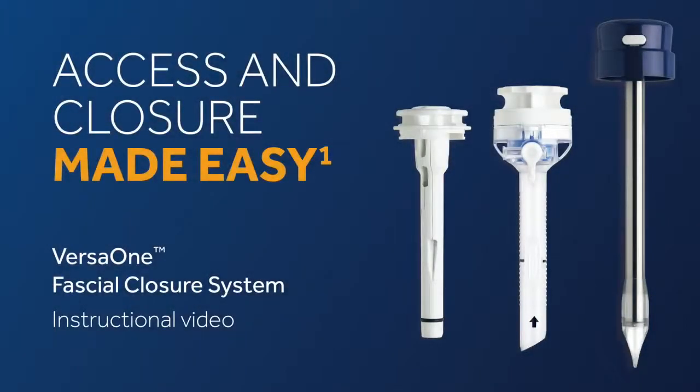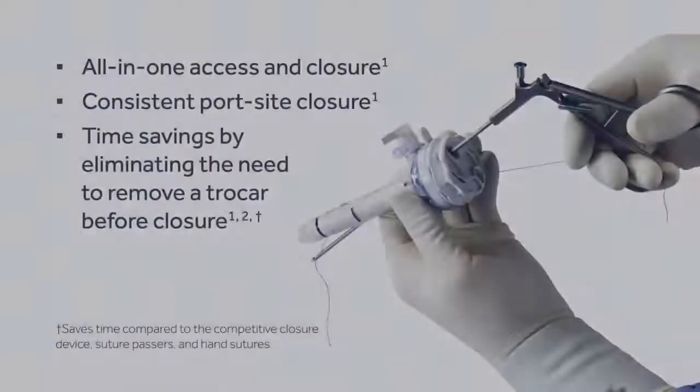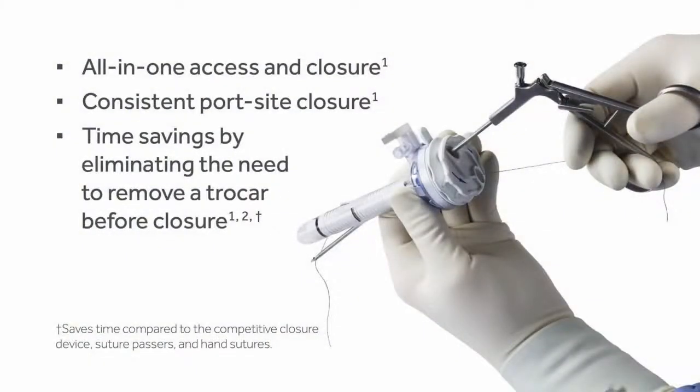Introducing the latest advancement in our VersaOne Trocar platform family: the VersaOne Fascial Closure System, an easy-to-use port site closure device that you can count on during laparoscopic procedures. The VersaOne Fascial Closure System is a multi-functional tool that serves as a Trocar and a fascial closure device.